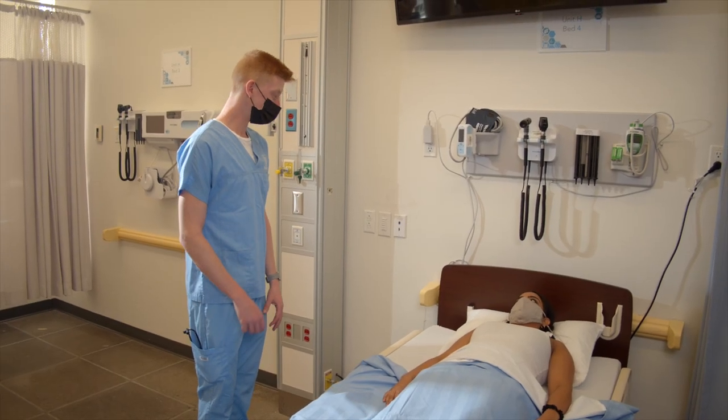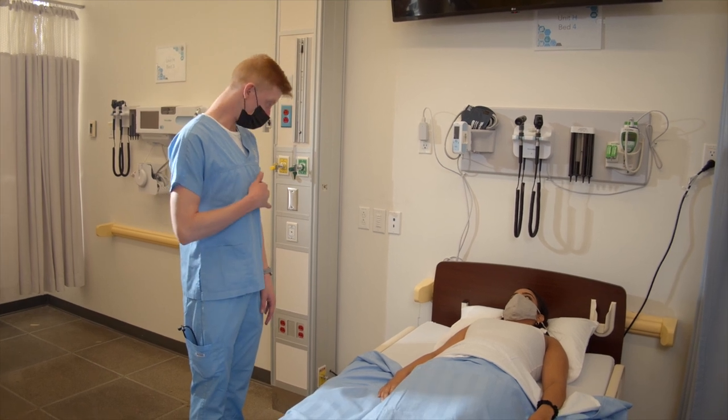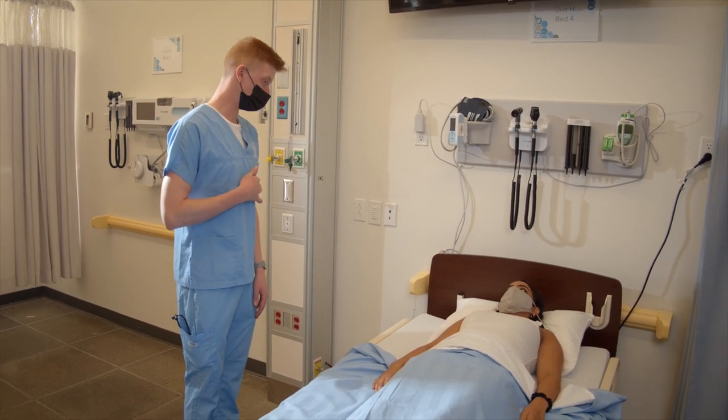Today I'm going to listen to your apical pulse. It's going to take me about one minute. I'm going to place my stethoscope about here. Is that okay?